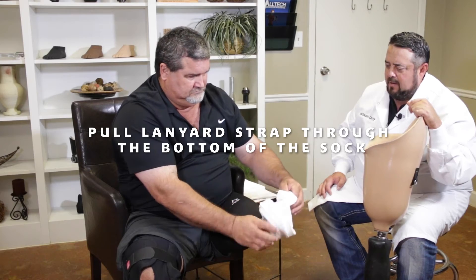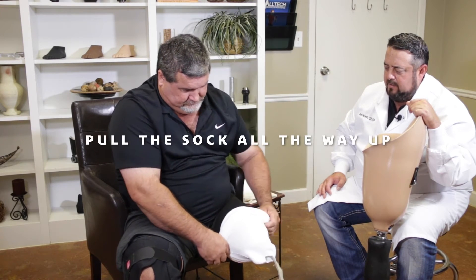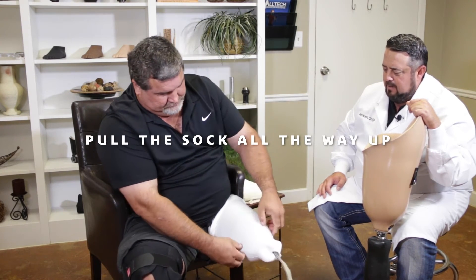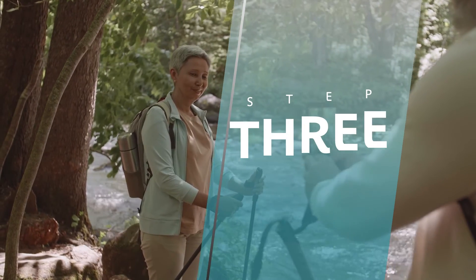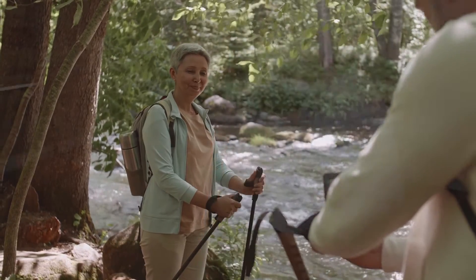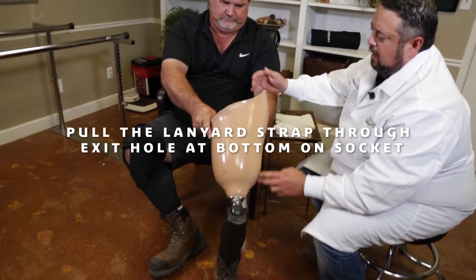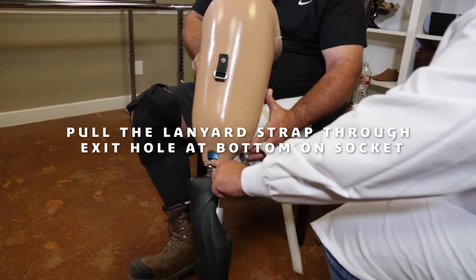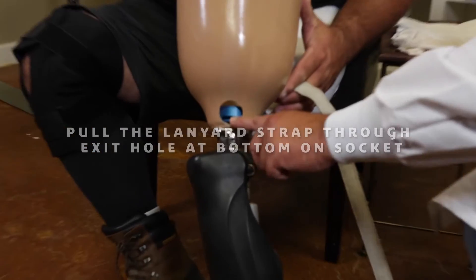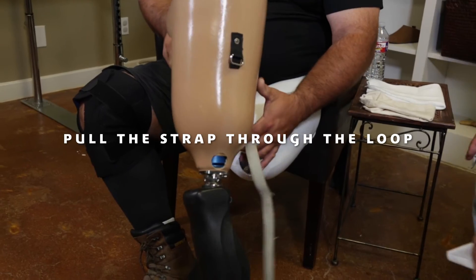The lanyard goes right through the bottom of the sock and he's going to pull the sock up all the way up — we have no wrinkles in it. Then what he's going to do is take the lanyard strap, drop it down through the bottom of the socket through an exit hole here, so the strap comes out there. He pulls himself into the socket, comes up through the loop, back down onto itself, and that locks him into the socket.